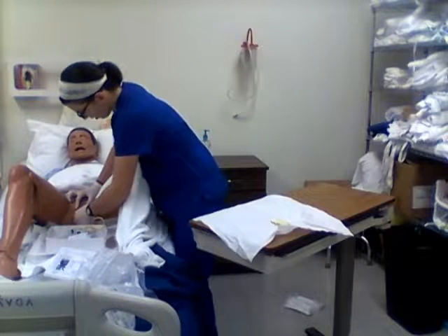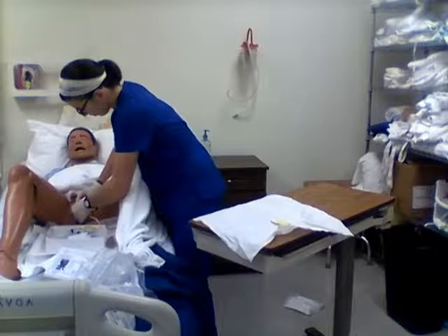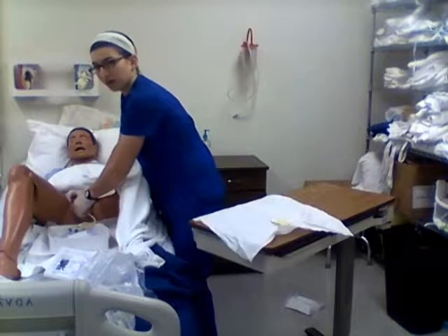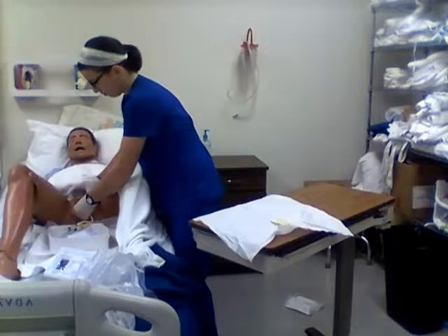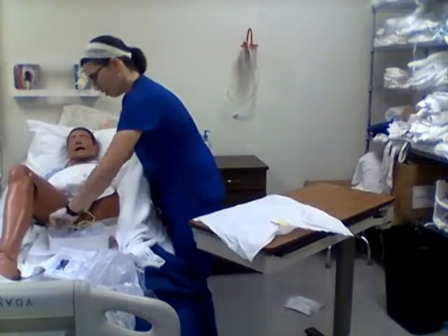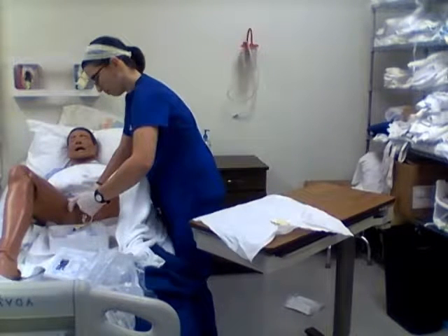So I can go ahead. All right, I am seeing a urine return, so I'm going to advance another inch. Now I can hold the end of the catheter with my non-sterile hand, and I can blow up the balloon with my sterile hand.